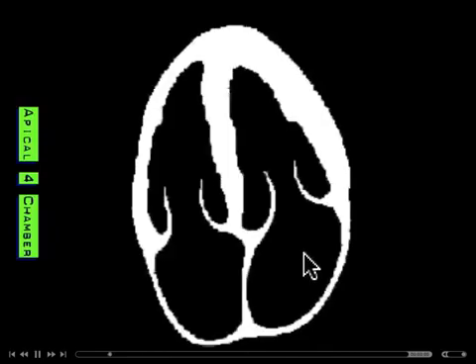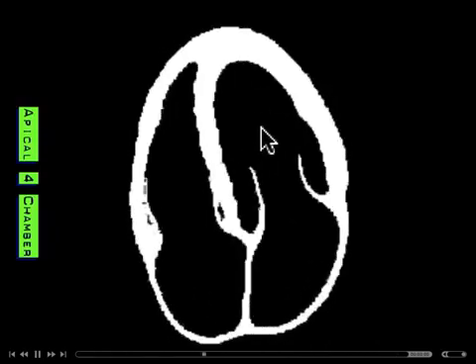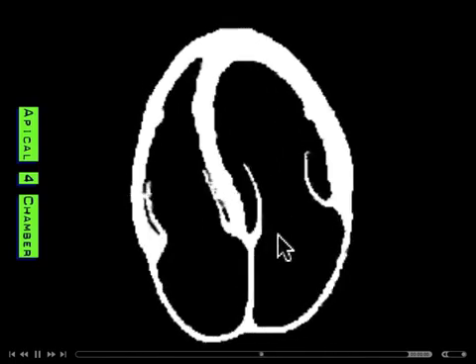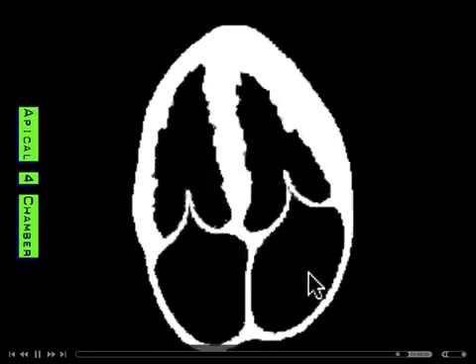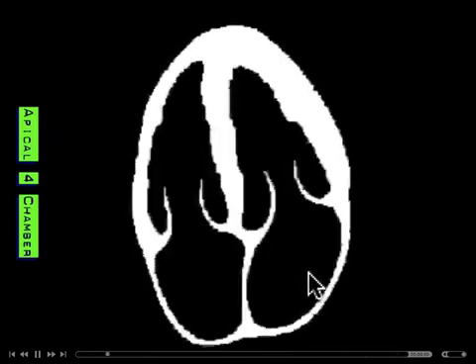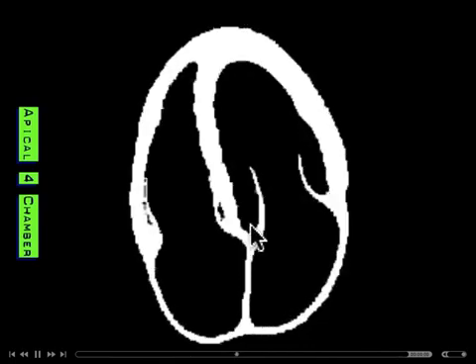The blood is flowing from the left atrium into the left ventricle. If we were to put a color flow signal along here, red would be flowing towards the probe, and blue would be flowing away from the probe. That's the idea, so keep that in mind as we go through this. By the way, the aortic valve is snugged right up in here. We're going to get to that in a minute, but that's where the aortic valve is.